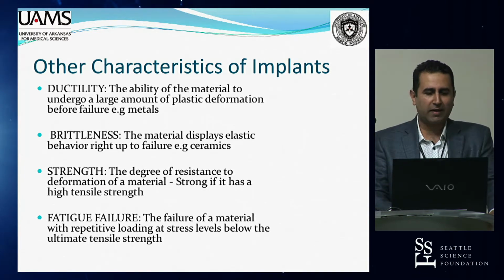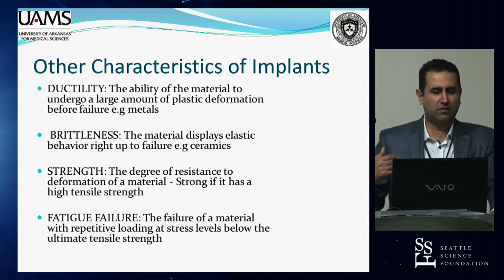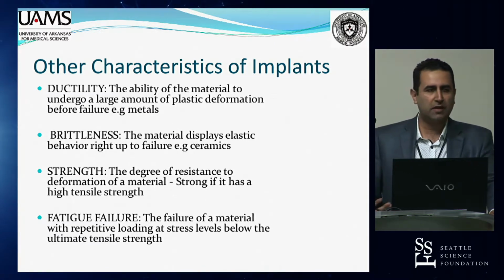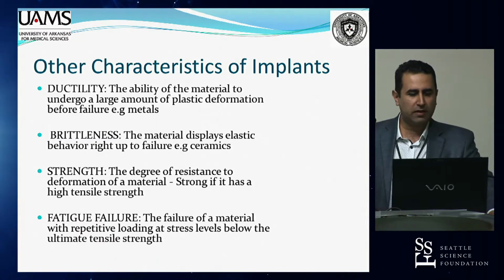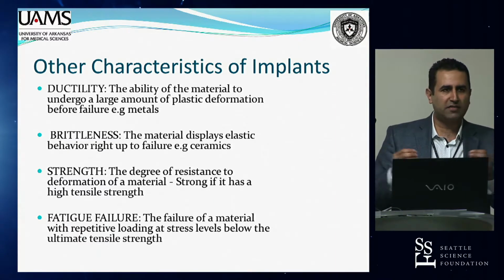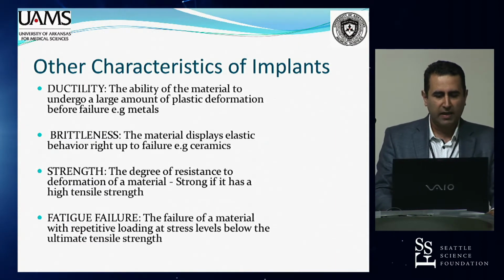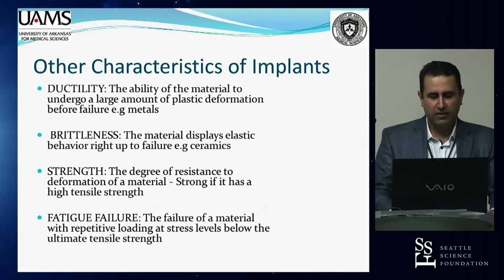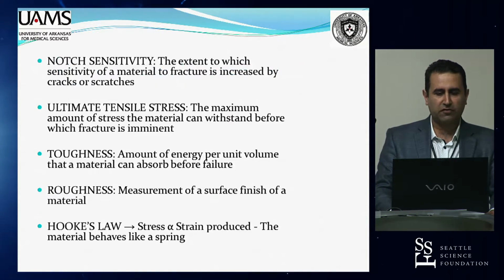So the implant can be measured in terms of its ductility, the ability of it to undergo a large deformation before it fails. Is it brittle? What elastic properties does it display? How strong is it? We've talked about its tensile strength. What about cycle failure, load failure, repetitive stresses before it fails?